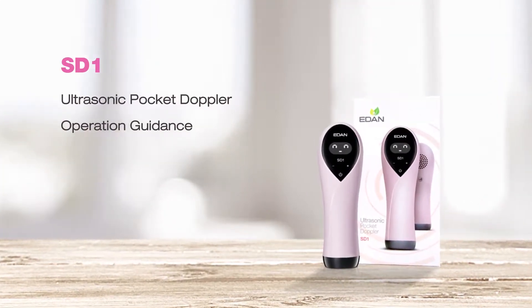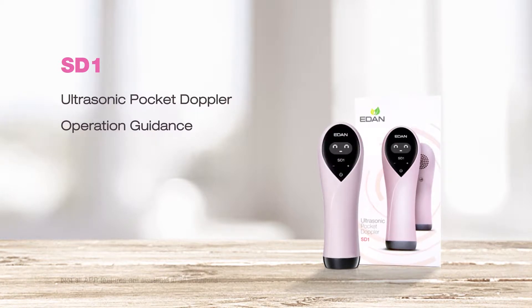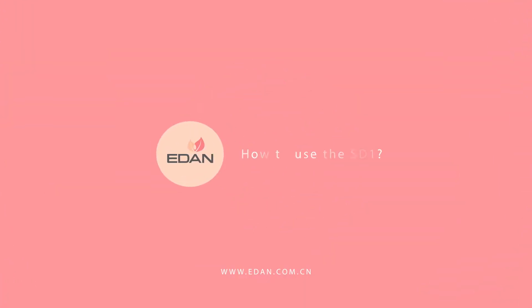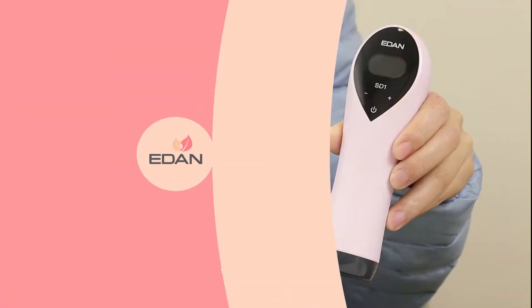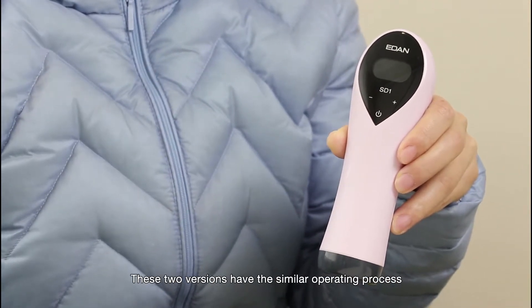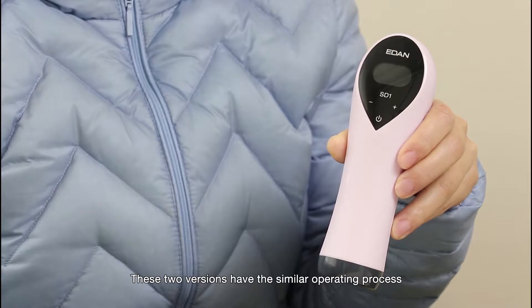Hello everyone. Today I will present our brand new FITO Doppler SD-1 and show you how to use it. Right now I will be showing you the Bluetooth version. These two versions have a similar operating process.